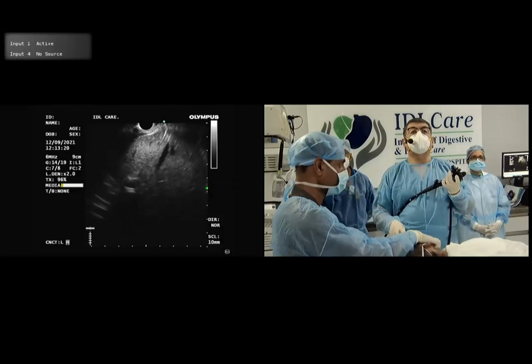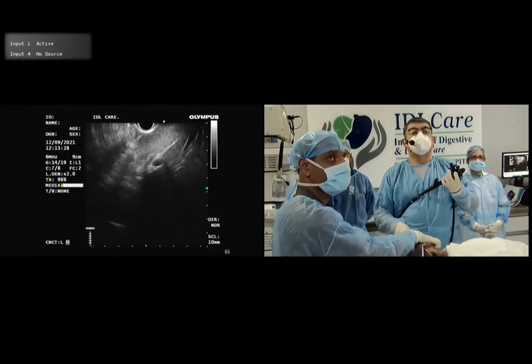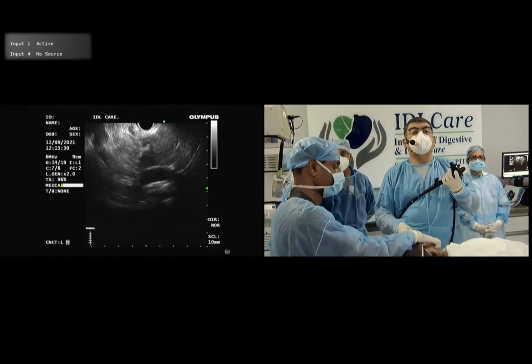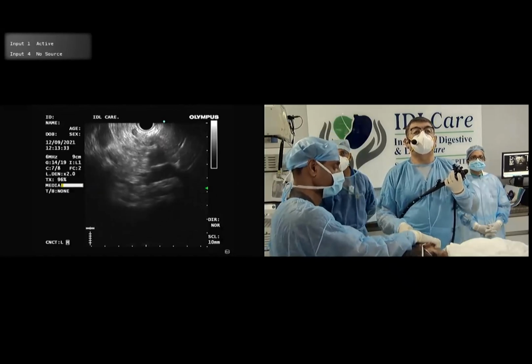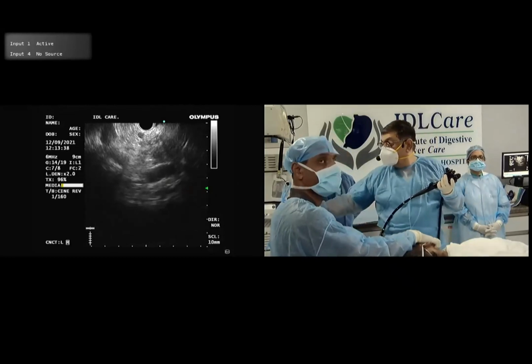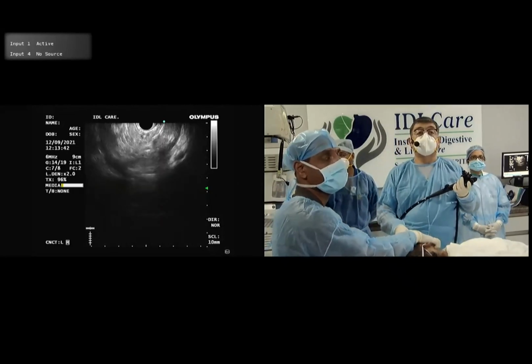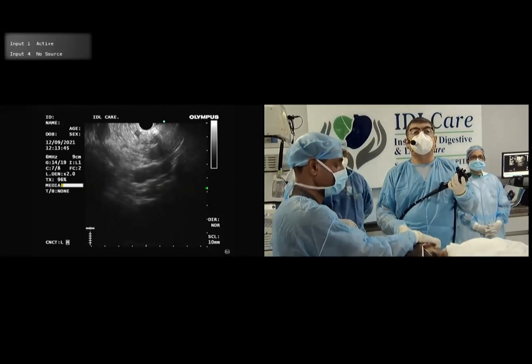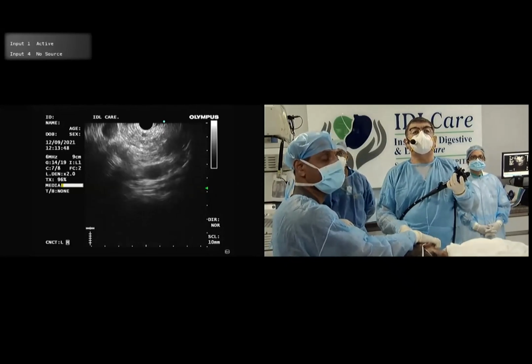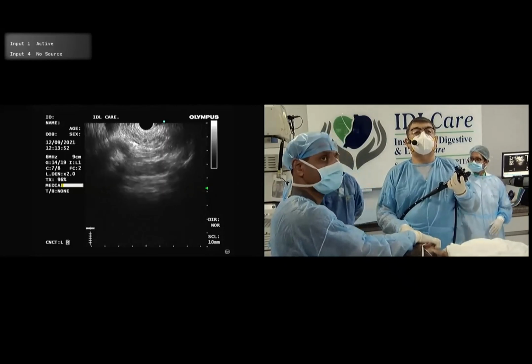See this? So this is a clockwise rotation. This is the middle hepatic vein. You go a little more down, turn a little more clockwise, and you start seeing the portal vein. Freeze. So this is the hilum, and this is the portal vein. So there are many methods. All of them are good. There is no preference. Whichever method you are used to, please use that method. But I'm just showing you the method that I follow.